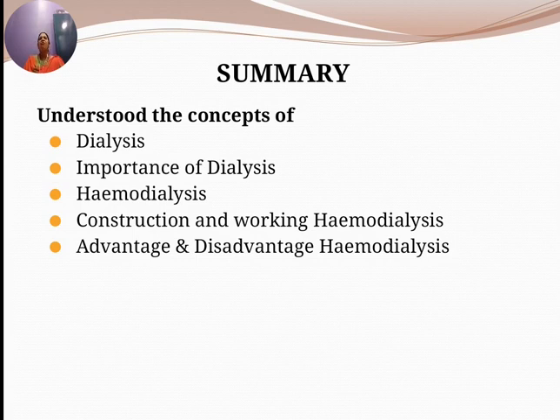The patients who are undergoing hemodialysis will usually have it done 3 times a week. So they have to travel to and fro. Advance notice must be given to arrange dialysis when visiting a dialysis center. So you have to take an advance booking to carry out this dialysis treatment. So these are the advantages and disadvantages of hemodialysis.